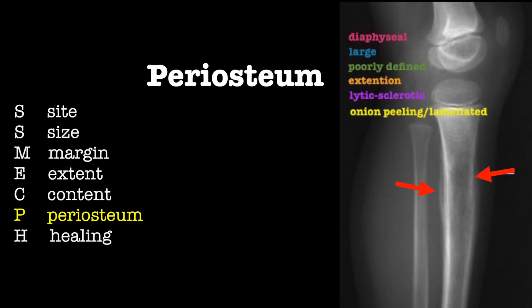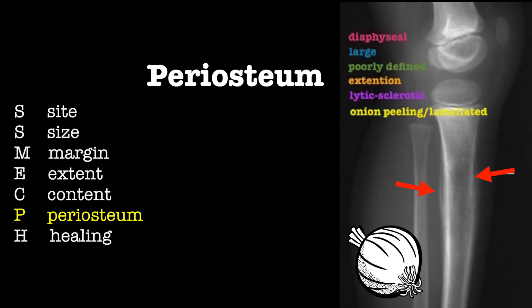Here you can appreciate the periosteal reaction and its onion peeling appearance, suggesting a more malignant or aggressive lesion.